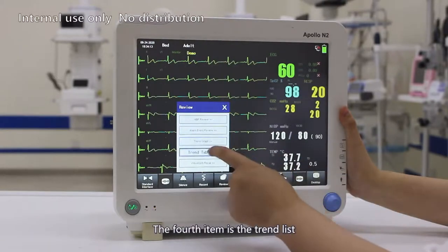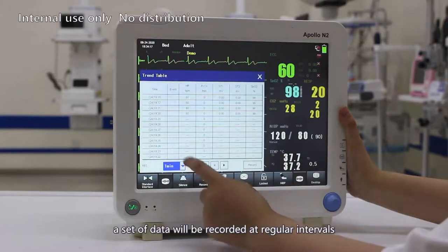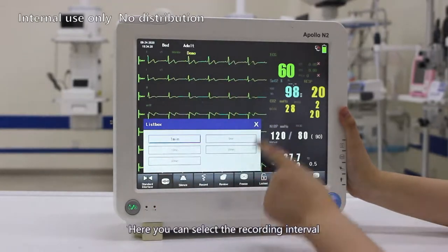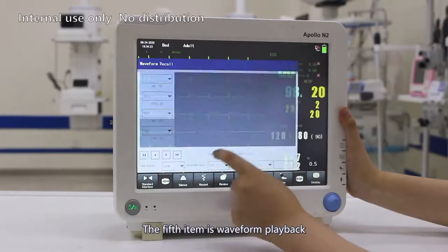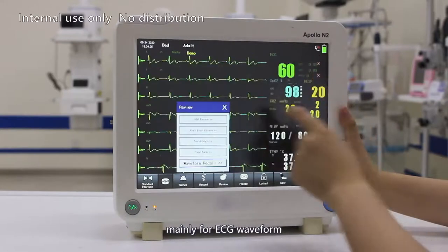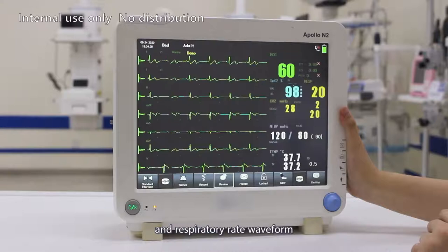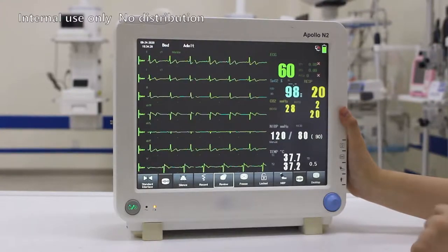The fourth item is the trend list. In the form of a list, a set of data will be recorded at regular intervals. Here you can select the recording interval. The fifth item is waveform playback, mainly for ECG waveform, blood oxygen waveform, and the respiratory rate waveform. These are the contents of the reviewing interface.